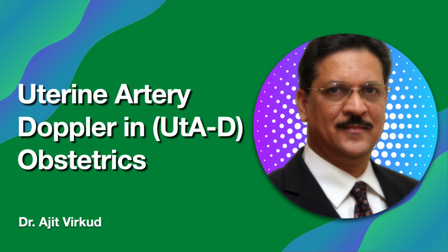Welcome to this masterclass on Uterine Artery Doppler in obstetrics. This is one of the most valuable yet frequently misunderstood Doppler applications in pregnancy. Today, we will move beyond outdated concepts and focus on current evidence-based practice, particularly why uterine artery notching is no longer the primary predictor, why the mean Pulsatility Index (PI) of both uterine arteries has emerged as the most robust marker, and the technical intricacies that determine whether your Doppler study is clinically meaningful or misleading. This session is particularly relevant for postgraduate exams, daily clinical practice, and high-risk pregnancy screening.